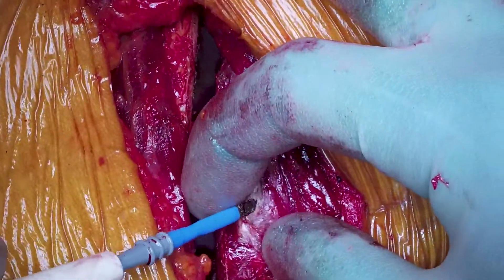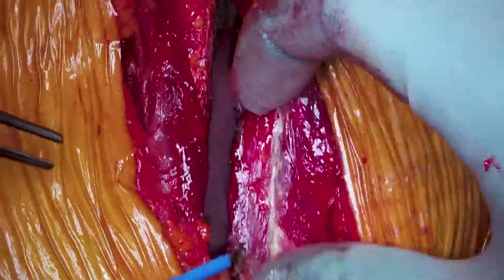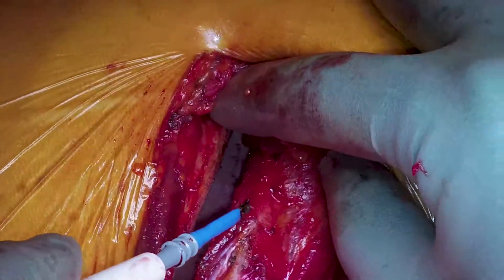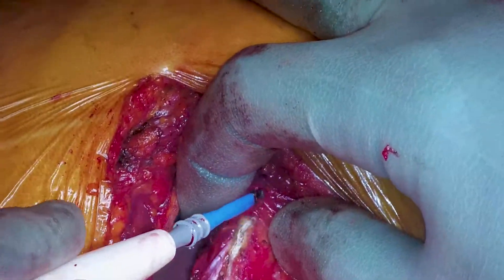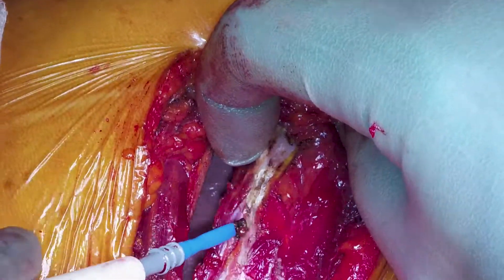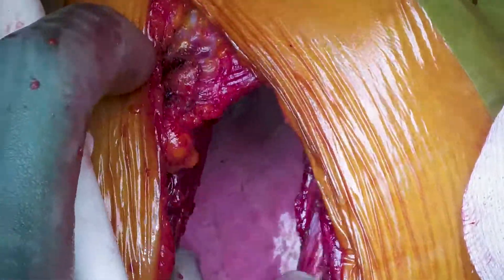This technique is used to preserve the intercostal nerve — it's called an intercostal strip. Mr. Dunning goes just above the rib and cuts out a chunk of muscle, letting it hang down to preserve the nerve, because cutting the intercostal nerve results in significant post-operative pain. The plan is to be as gentle as possible with this neurovascular bundle, because if done incorrectly, the rib will sit on the nerve and crush it under the retractor, causing immense and completely unnecessary post-operative pain.